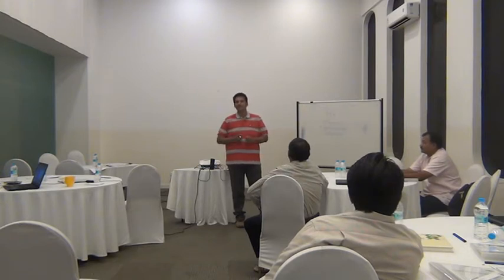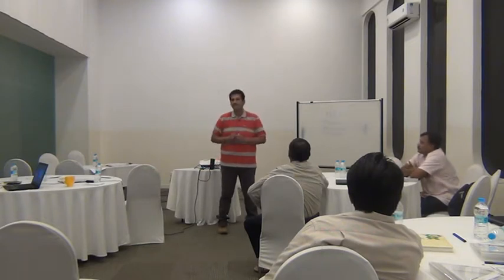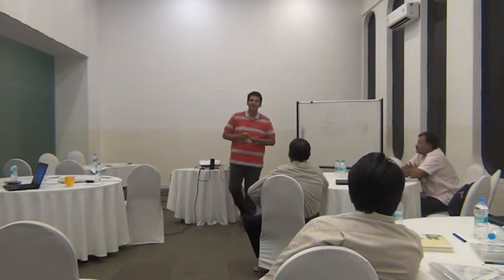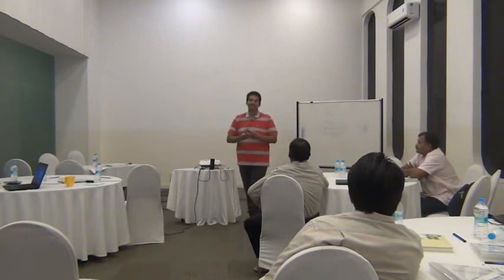You want to take an image. That is one way of doing it. One way is to take a camera, go inside the body, take an image. So that is actually done. You call it an endoscope. An endoscope actually is a long tube which has a camera and it goes directly to the point and it takes an image. Whereas the other way of doing the thing is you use some phenomenon connected with that.